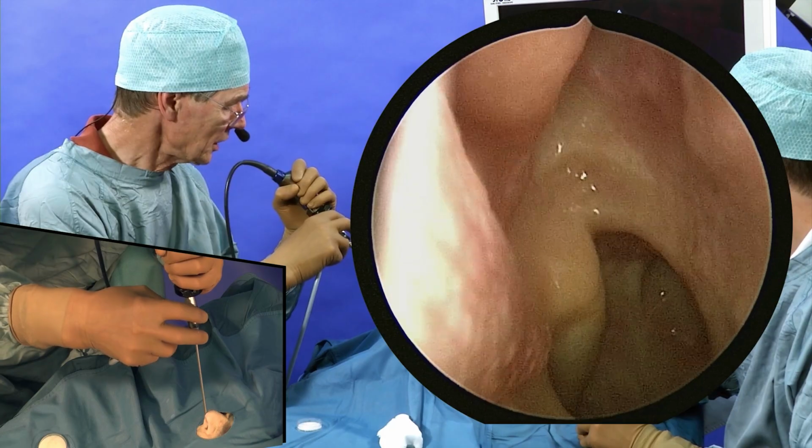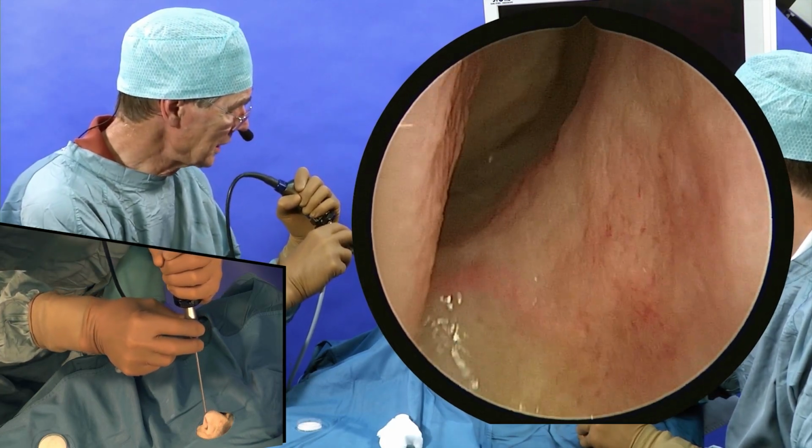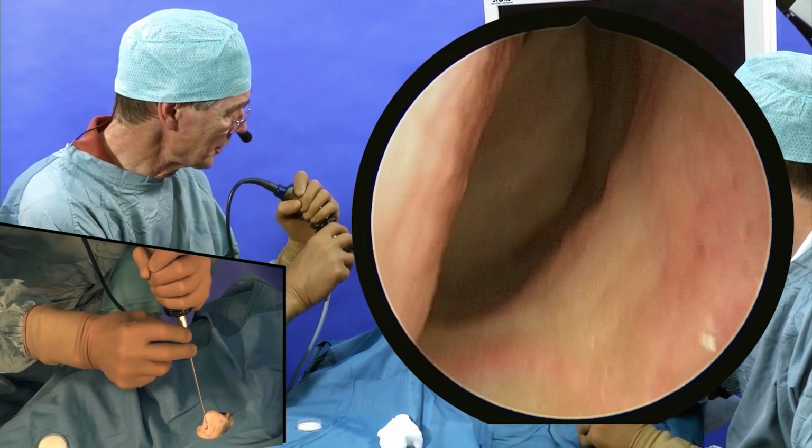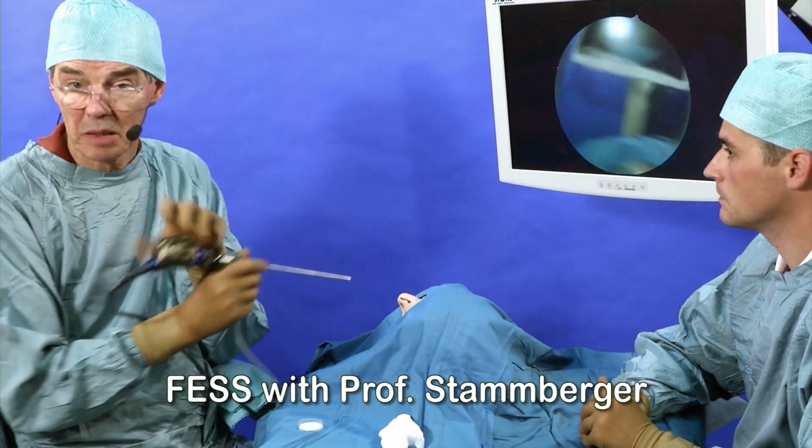So this is a nice tool for diagnostic endoscopy that is on the market right now. The Endocameleon, that is.